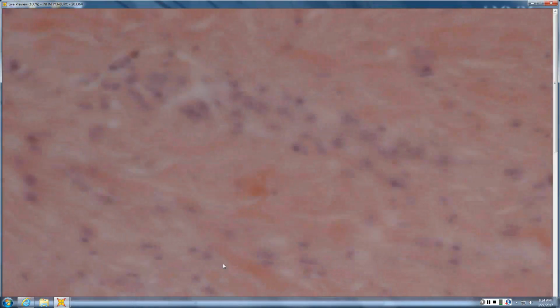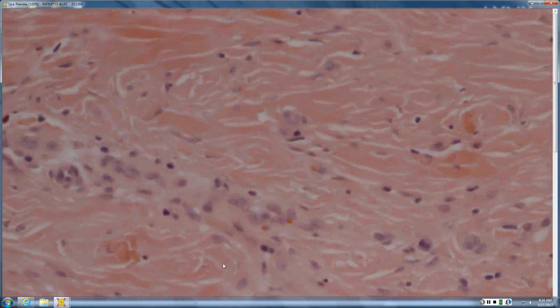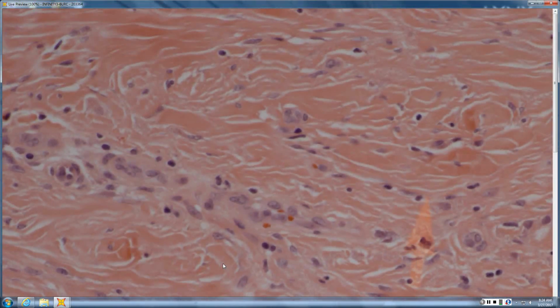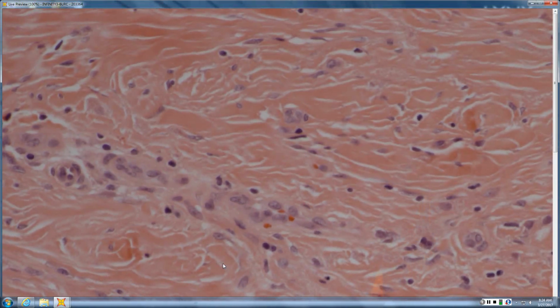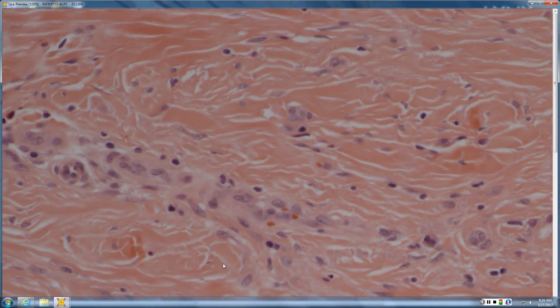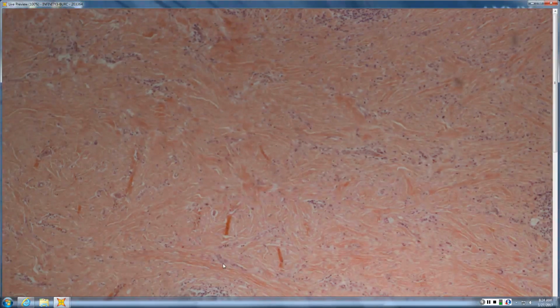And this is actually S100 positive, but when you look through it, there are these poorly formed granular cells. It probably doesn't matter if you're calling it a DMM or a malignant granular cell tumor. Behavior is going to be pretty similar. What are the hints that granular cell tumors are malignant?